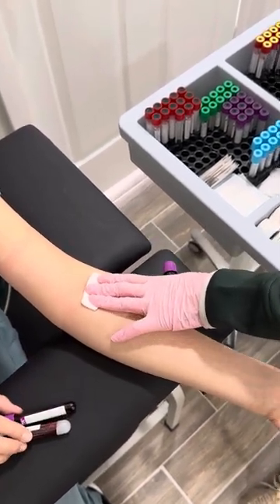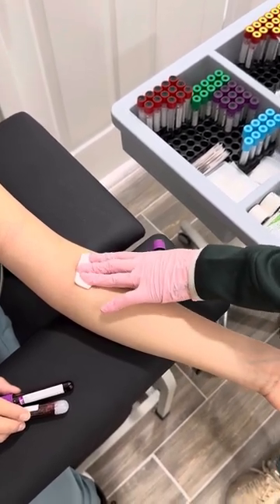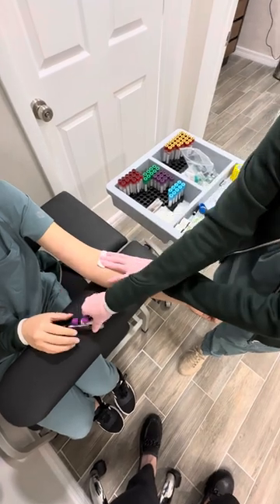If you leave the tourniquet on and you pull the needle out with it on, it can bruise really bad. It's the back pressure — the blood will also try to come out too.